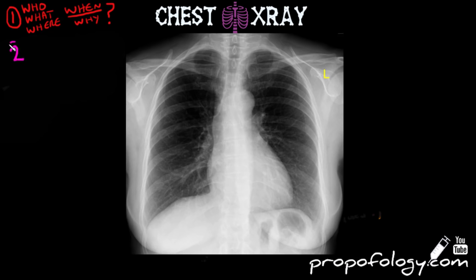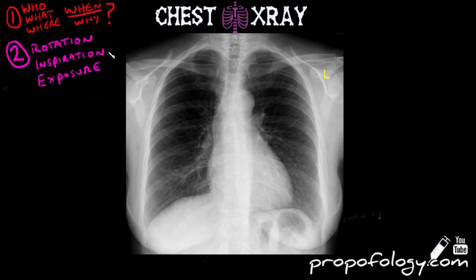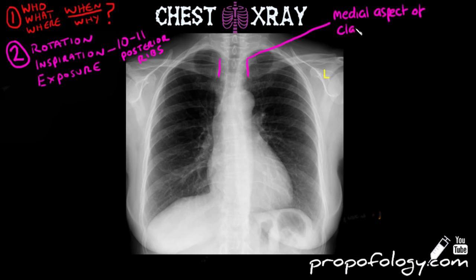Next you should look at the aspects that affect the quality of any given chest x-ray. Check the rotation — are the medial ends of the clavicles equidistant from the spinous processes? Check inspiration — is it adequately inspired, and are 10 to 11 posterior ribs seen in each lung field? And how is it exposed — is it too bright, too dark, and can you see everything that you need to see?